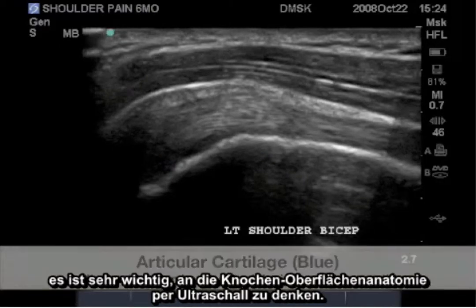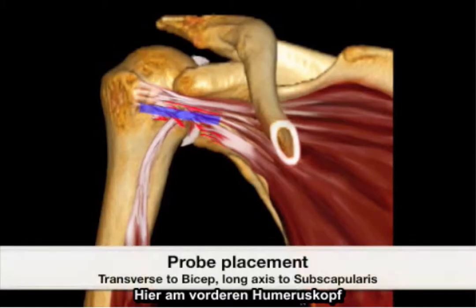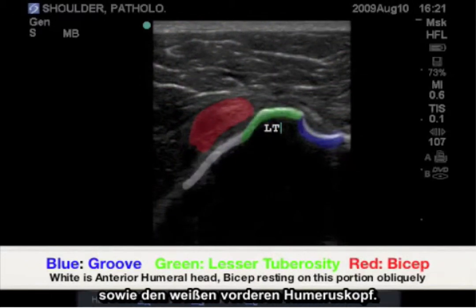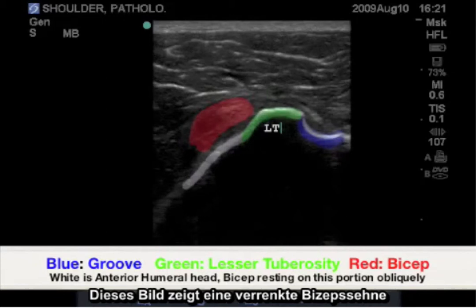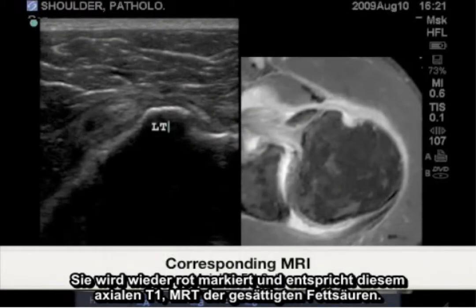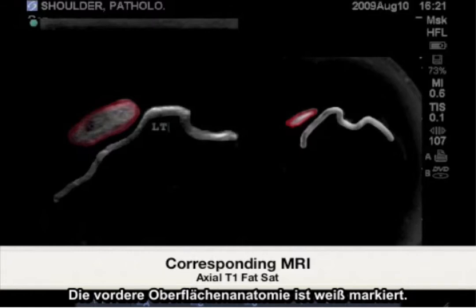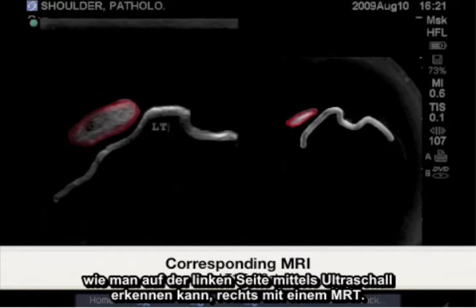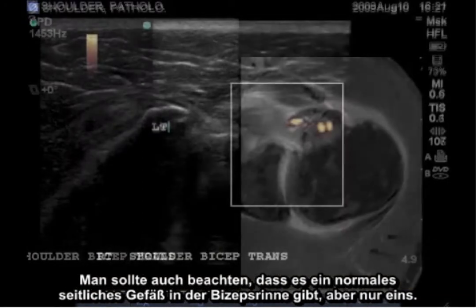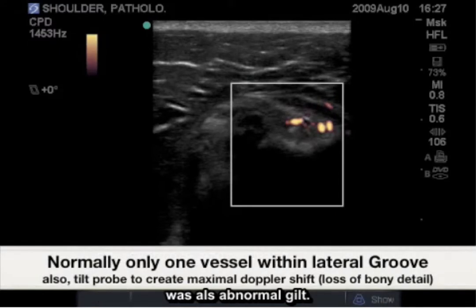When pathology presents itself, it's very important to remember the bony surface anatomy associated with ultrasound. Here at the anterior humeral head, it's important to recognize the green marked lesser tuberosity, the blue bicipital groove, and the white anterior humeral head. In this image, we have a dislocated bicep tendon located over the anterior surface of the humeral head, highlighted in red, corresponding with this axial T1 FATSAT MRI. Highlighted in white are the anterior surface anatomy as seen on the left with ultrasound and on the right with MRI. It's also important to note that there's a normal lateral vessel to the bicep groove, but only one. In this case, we see multiple vessels throughout the bicipital groove, which is considered abnormal.